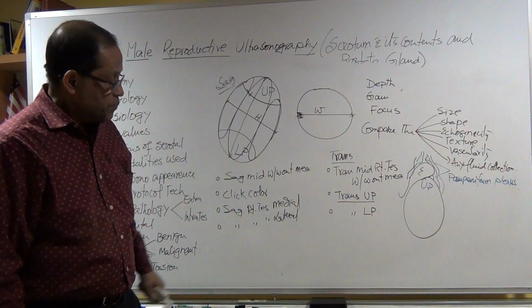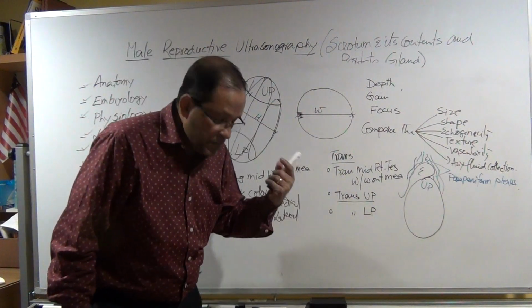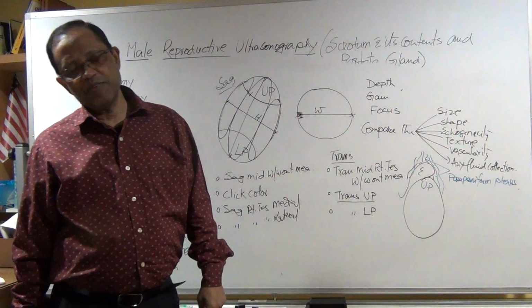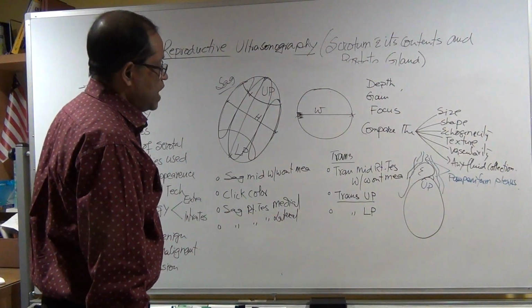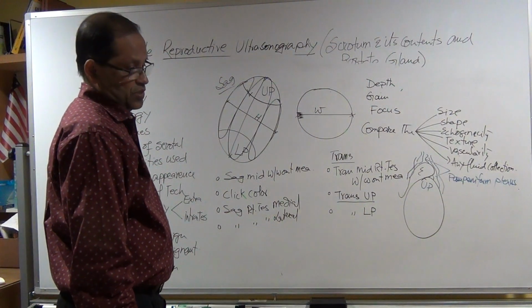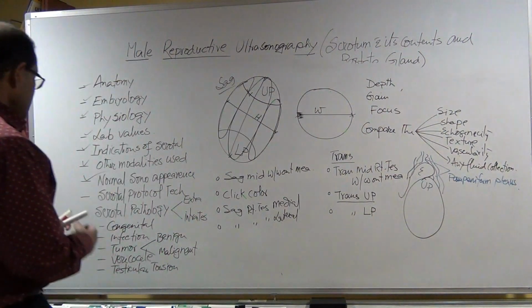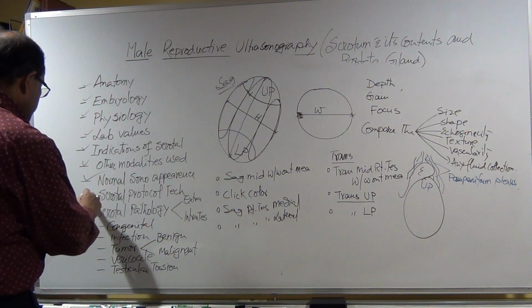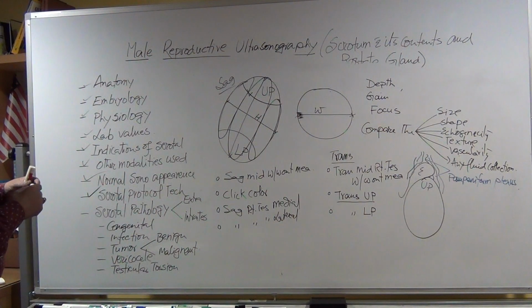Now, question. If I see something, can I take more images? Of course. Of course, you can take more and more and more images. Okay, so then you're going to complete the protocol, then scrotal pathology.